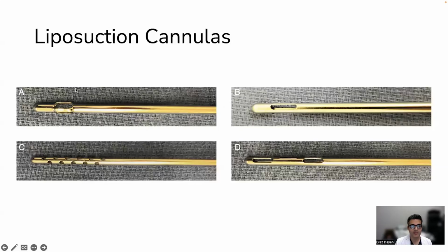And then after that, we'd come back in with a basket cannula to equilibrate the fat. So again, off suction, we would pass the basket cannula to spread the fat that's there and make sure that everything is equal. So separation, aspiration, fat equalization is the SAFE acronym.